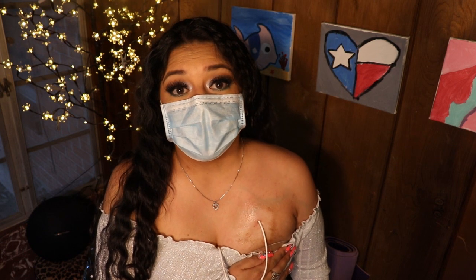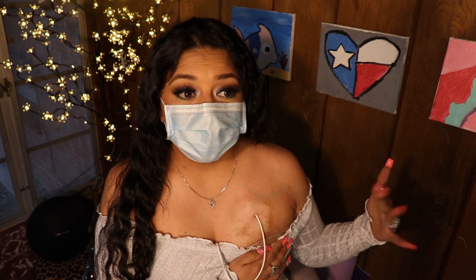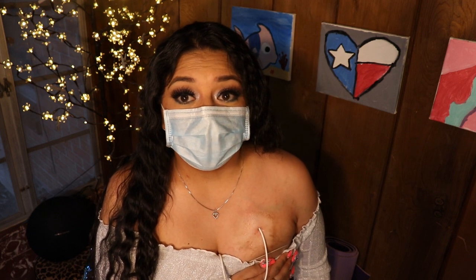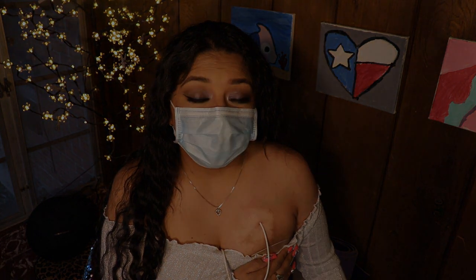No sweat — you have to switch it out more than once a week. After he does all the alcohol swabs, you let it dry completely. You're never supposed to fan it. You're never supposed to blow on it. You're never supposed to put any kind of wind on it whatsoever, because then you're just putting germs into your site, straight to your heart. And that's nothing you ever want to do. So never touch it or blow on it or any of that stuff. So now we just sit here and wait for it to dry.